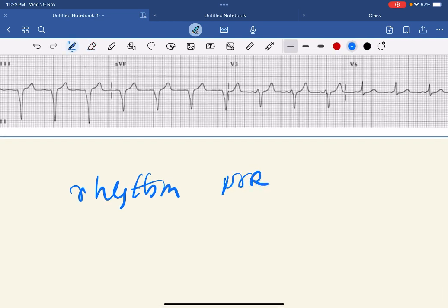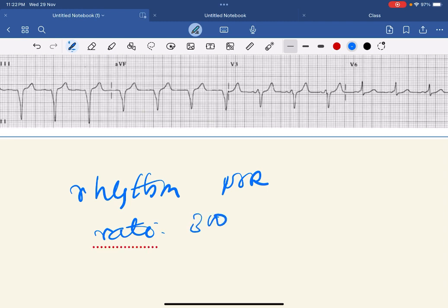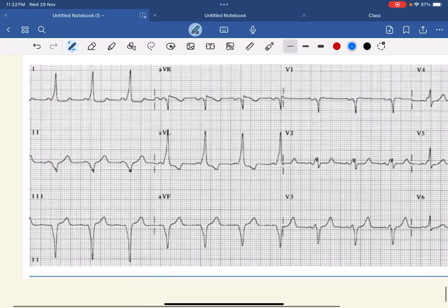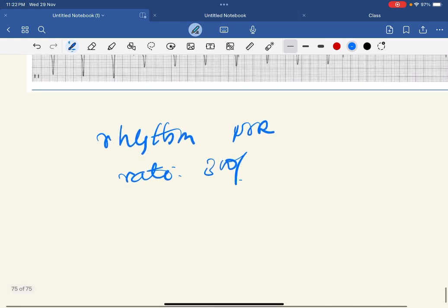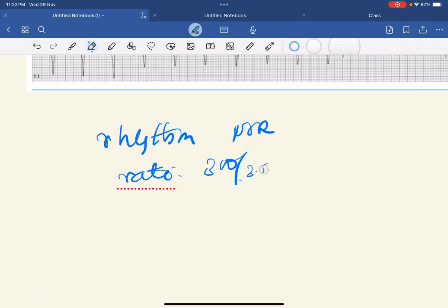After that, you have to calculate the rate: 300 over the number of big boxes between 2 R waves. It is around 3 and a half to 4 big boxes, so the rate comes to somewhere around 75 to approximately 80 beats per minute.